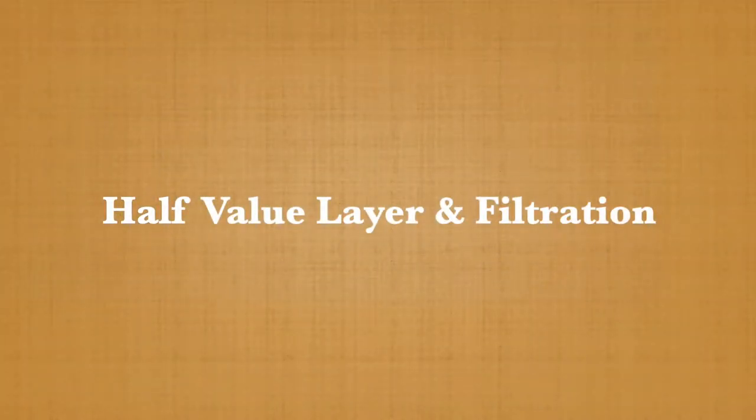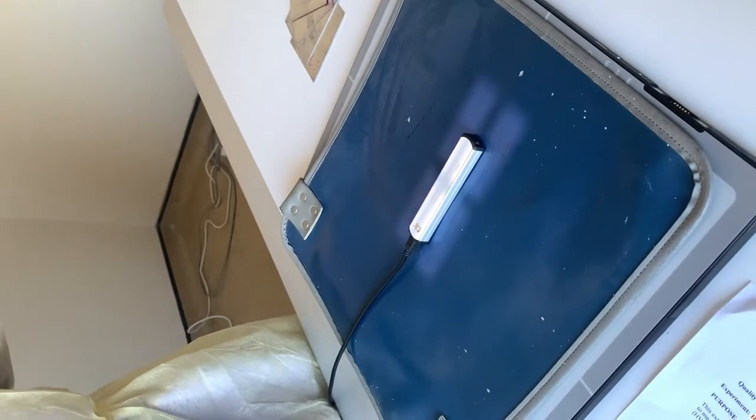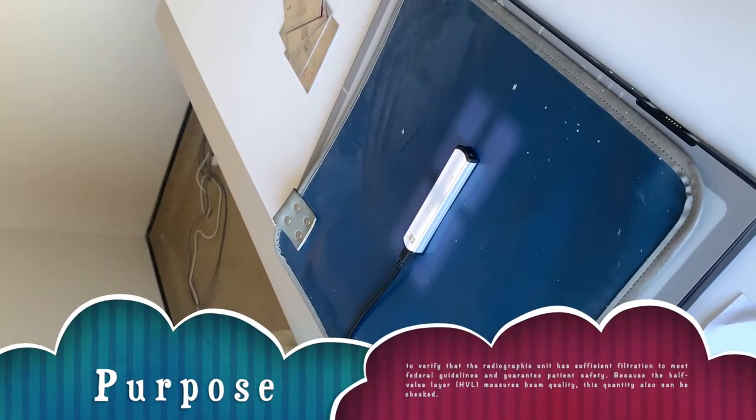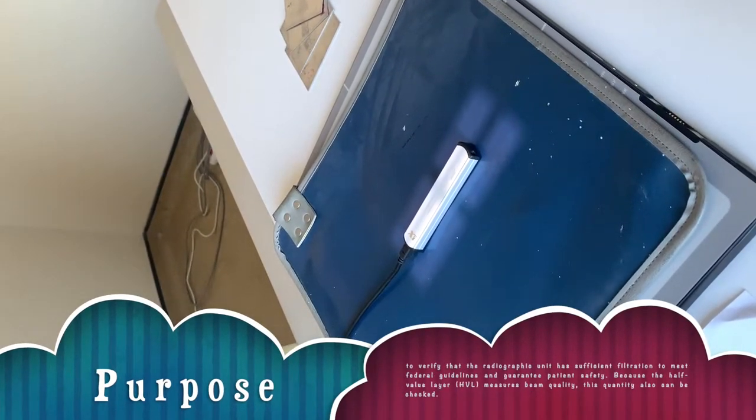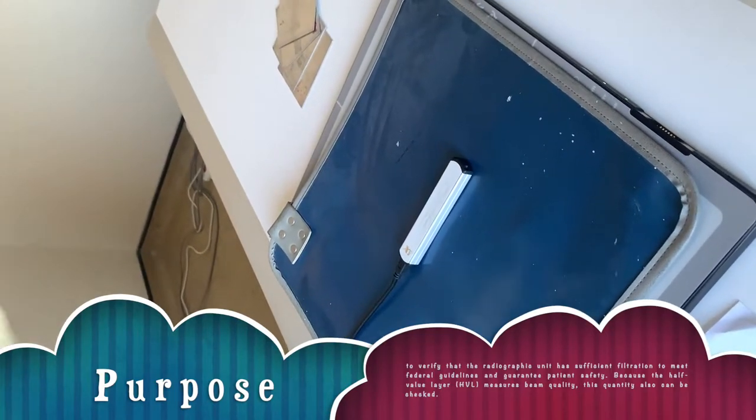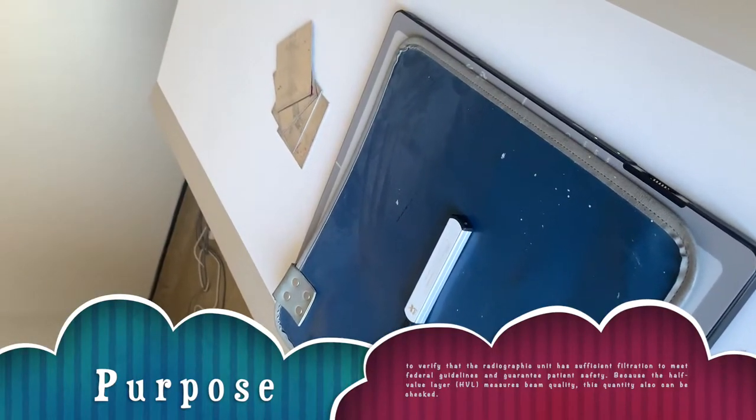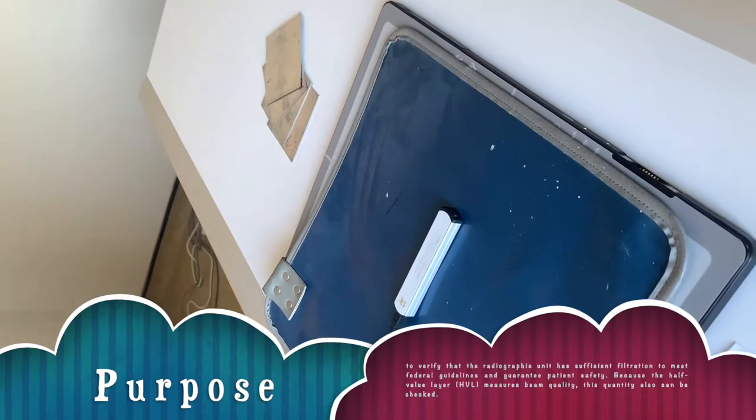So now we are doing the half-value layer measurement quality assurance. This experiment is done to verify the radiographic unit has sufficient filtration using aluminum sheet to verify the half-value measurement beam quality.